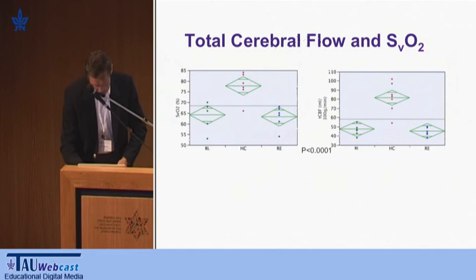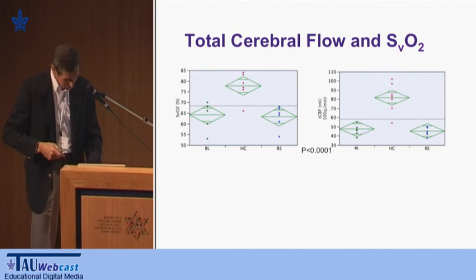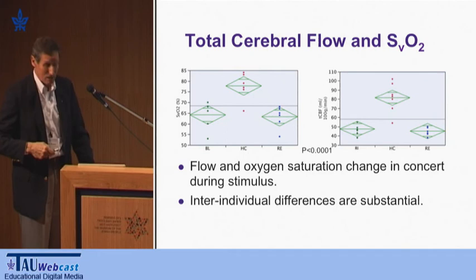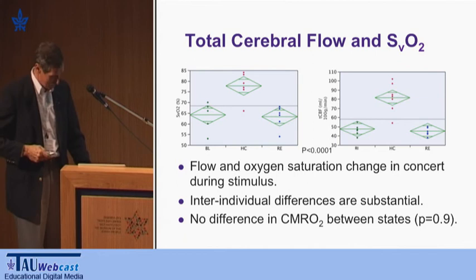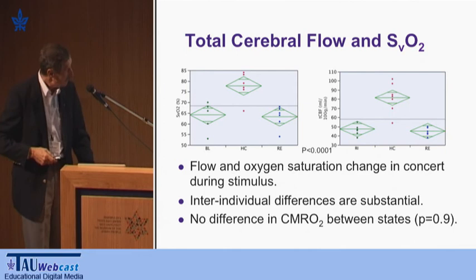These are the results from a few volunteers. Baseline, hypercapnia for SvO2, returning to baseline, and this is highly statistically significant. So flow and oxygen saturation change in concert during the stimulus, and the intervidual differences can be quite substantial, but there is no difference in CMRO2 between states. This has been debated, and there is literature in support of this and against this finding, but we have quite a bit of confidence that this is real.